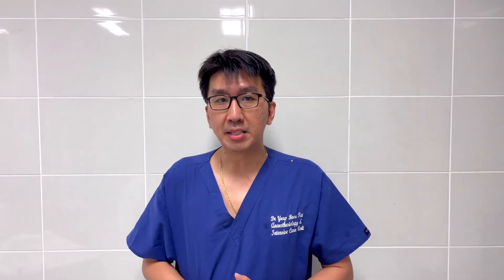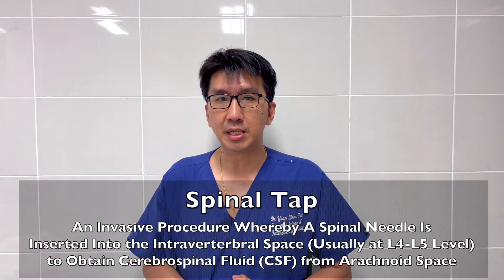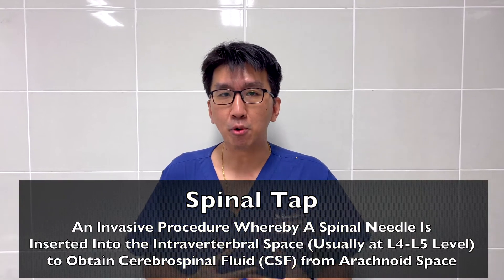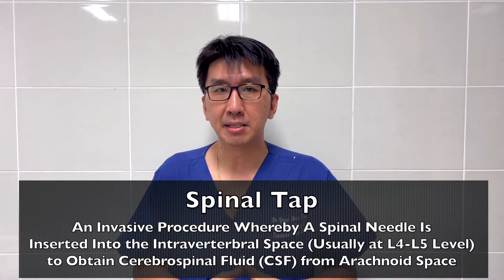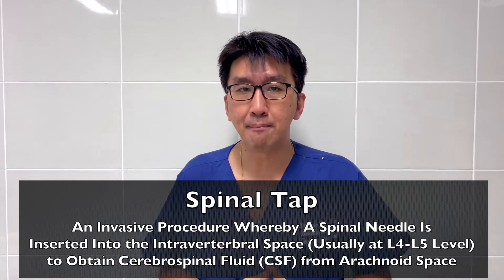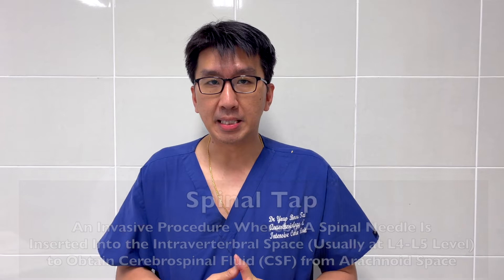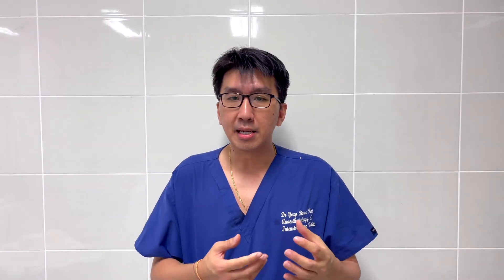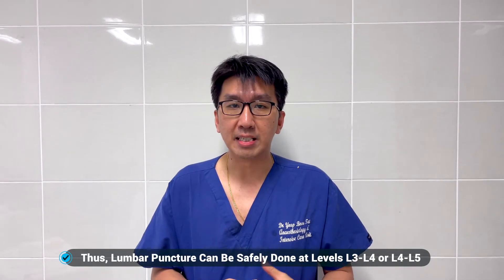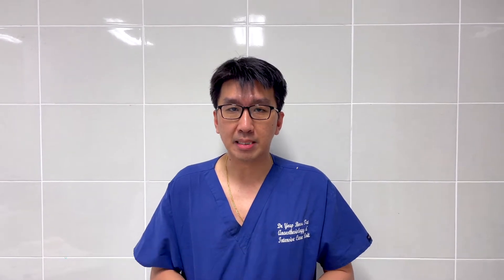Lumbar puncture is an invasive procedure whereby a spinal needle is inserted into the lumbar intervertebral space, as the cerebral spinal fluid will be removed for investigation purposes.